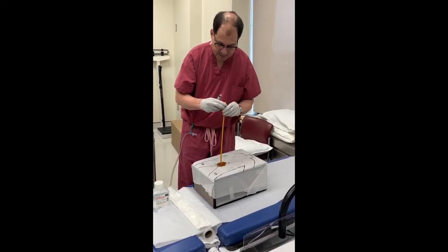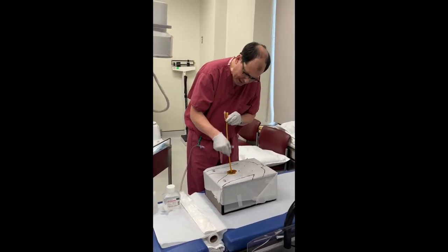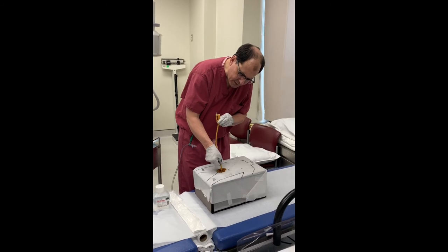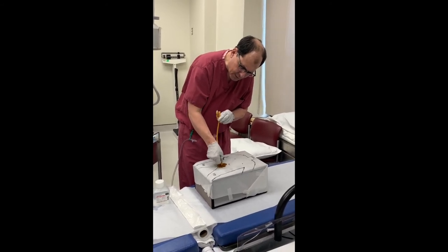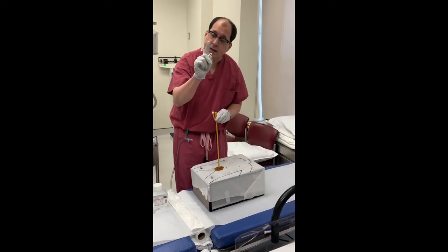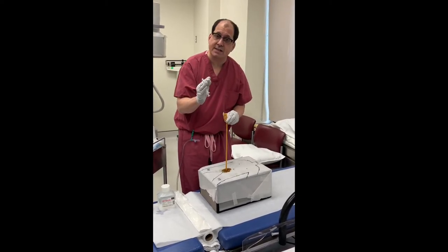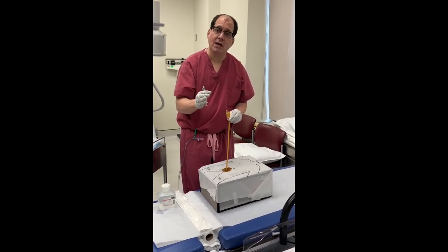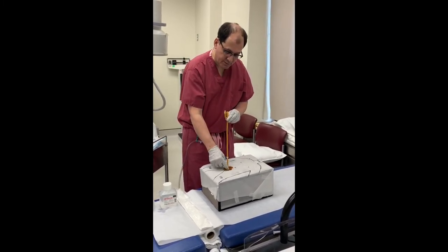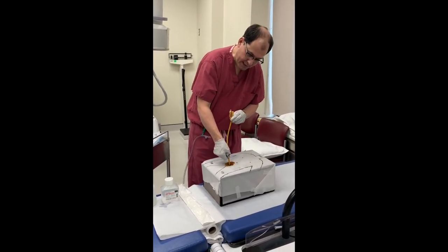Once you feel some resistance, if you're not sure whether the catheter is in place, move it in and out. Does it move easily in and out? You see that — it moves in an inch, back and forth. That means it's in a good place. If you try to move it and it's fixed, it's probably in the wrong place — it's in the prostate, in the wall of the skin, or something like that. So just make sure it moves back easily.